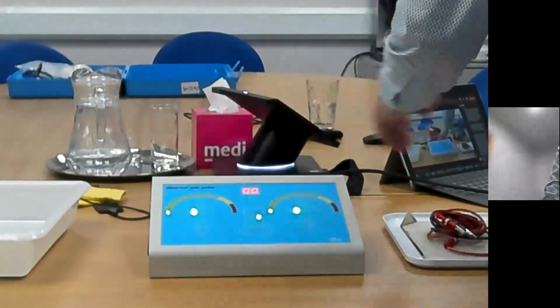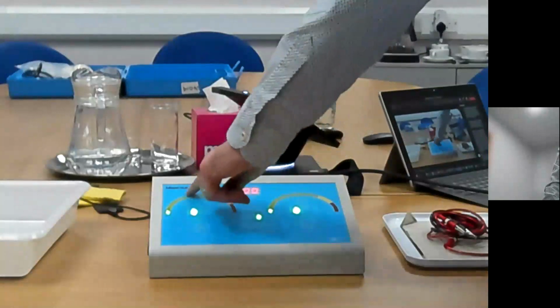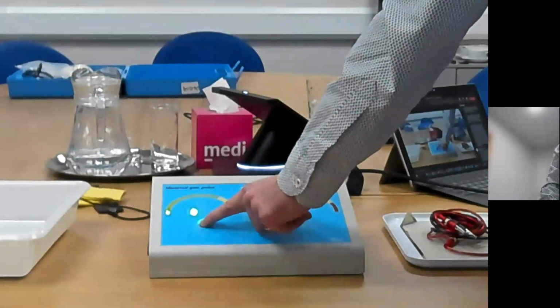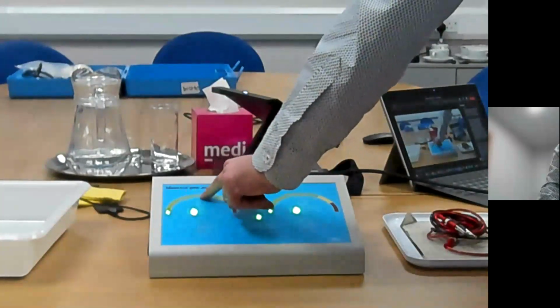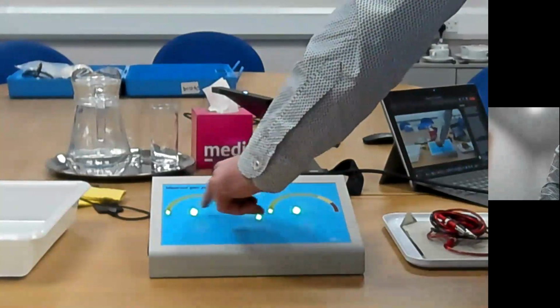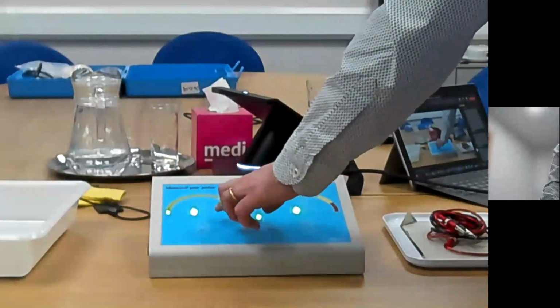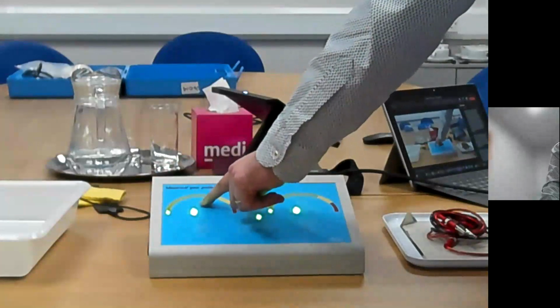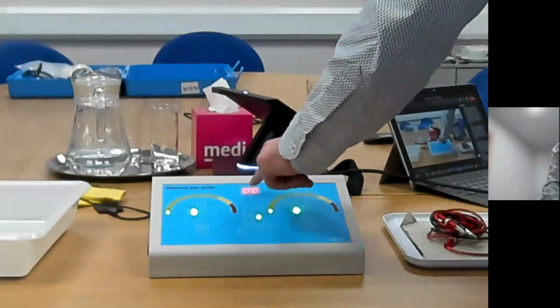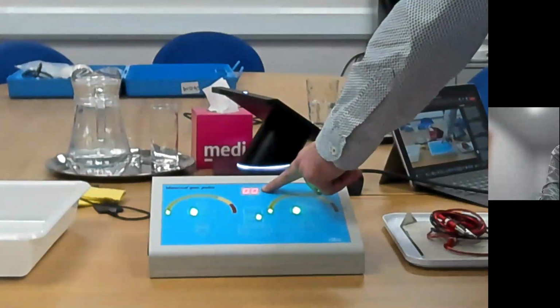When you've set the device up, and I'll run through setting it up in a moment, you use the up and down arrows on the generators there to increase the current by pressing repeatedly or holding the button down. The lights will start to light up on this indicator dial here as the current starts to flow. Now, the current's not going to flow at the moment because there's no circuit detected by the device. The milliamp light will show in the middle of that dial there when the current is flowing, and the timer will start to count up in minutes once the current has started to flow.